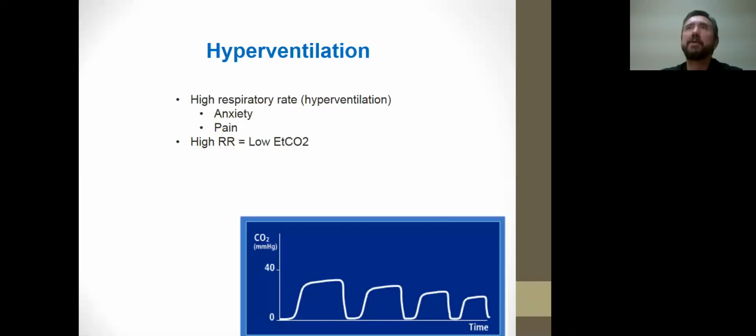With hyperventilation, when a person hyperventilates, their CO2 is going to go down, right? Hyperventilation can be caused by many factors, from anxiety to bronchial spasms to pulmonary embolism. Other reasons CO2 may be low could be cardiac arrest, decreased cardiac output, hypotension, hypothermia, or severe pulmonary edema. One thing we want to remember is that ventilation equals tidal volume times the respiratory rate.